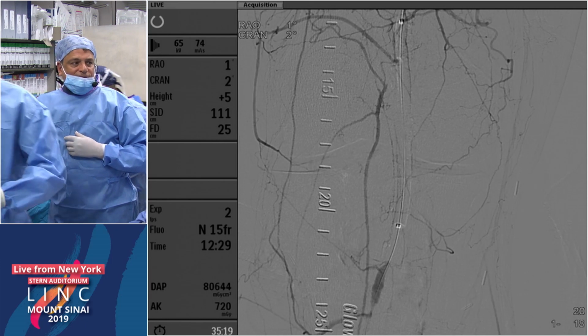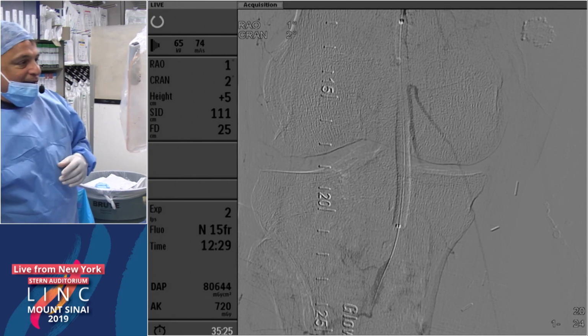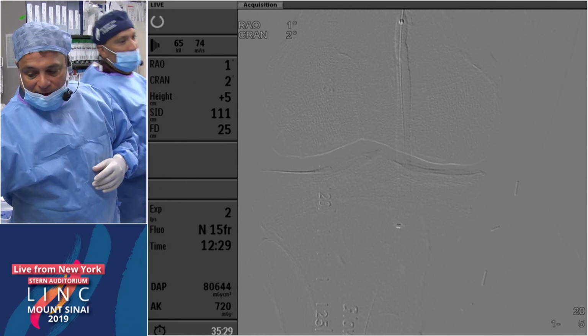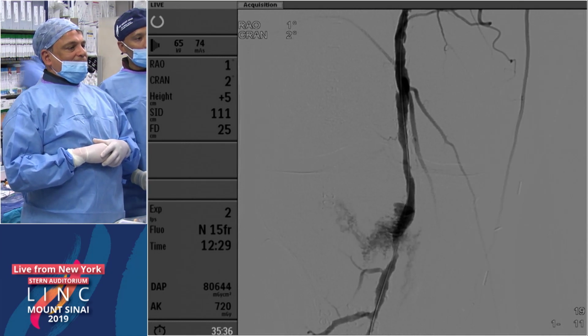So I just want to ask you guys, as you see, we had a little bit of a perforation. And Brian, I know you and I talk about this in Endomasters all the time. So we just made 2 passes with the Hawk 1M. It was a 5-millimeter vessel by IVUS, and this is what we ended up with right there.